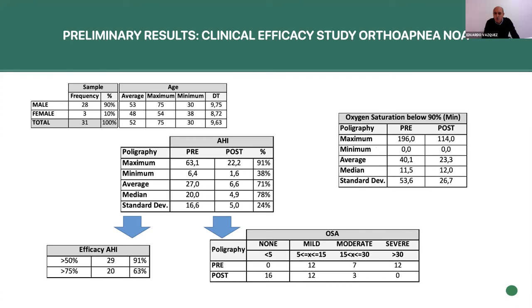Now, something very important: with the NOA, we start, let's say, with 50% of mandibular protrusion, which is a very moderate degree of protrusion, we know that when the patient opens the mouth and is at 10 millimeters of mouth opening, the patient is really going to be at 60% of mandibular protrusion. But we also know. So in the clinical study you just showed in this last slide, what was the average amount of protrusion percentage-wise? I think I recall that the average was around 60%. Okay.